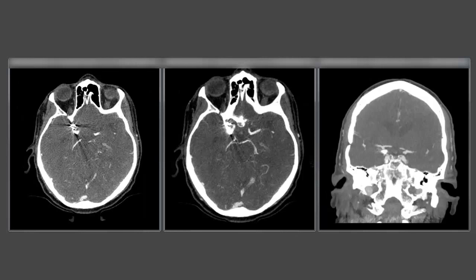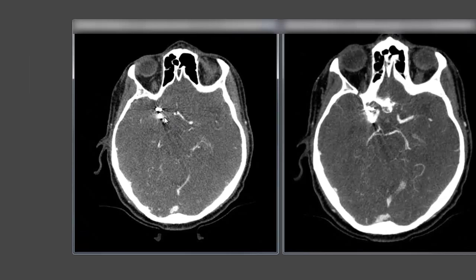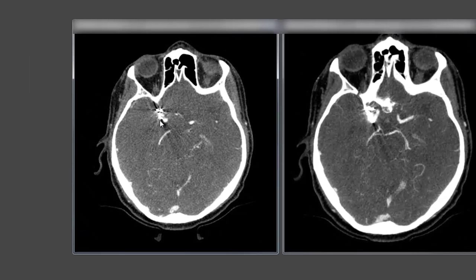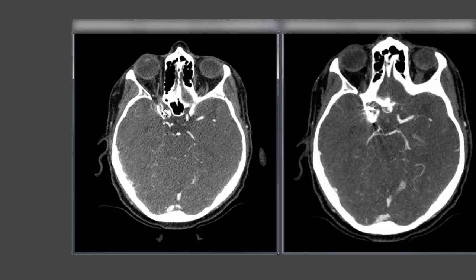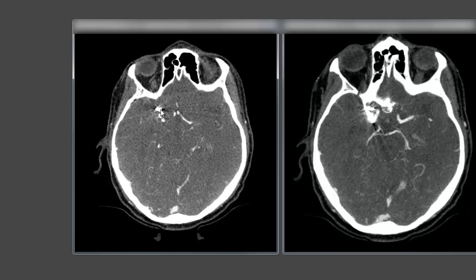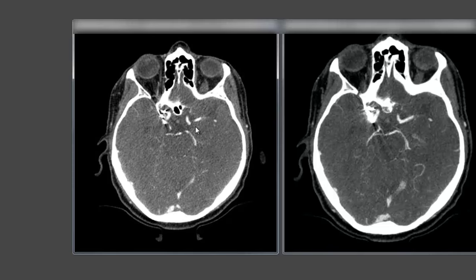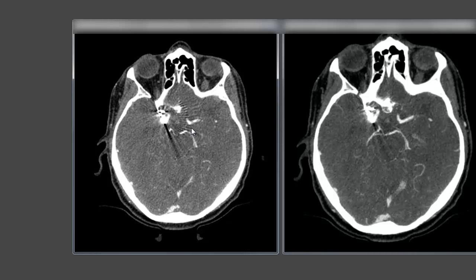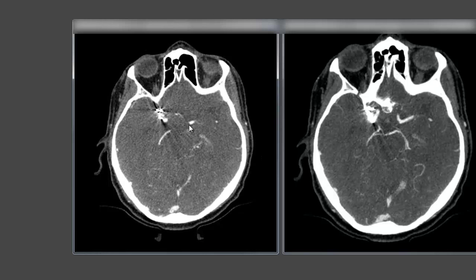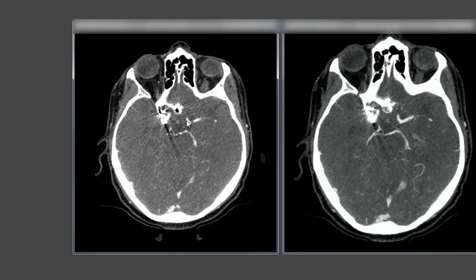Here's another example of an MCA occlusion — in this case a left MCA occlusion. Again we have source images and two planes of thick MIPs reconstruction. On the source images, this patient provides a bit of a distraction because they have a history of a cerebral aneurysm that was clipped, resulting in some scattering beam hardening artifact on the right side. Focusing on the area of interest on the left side, in this patient with right hemiparesis and aphasia, we see the carotid terminus coming up.